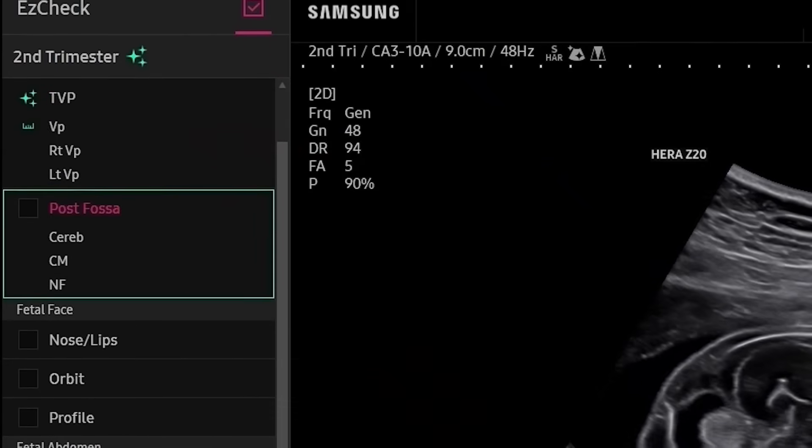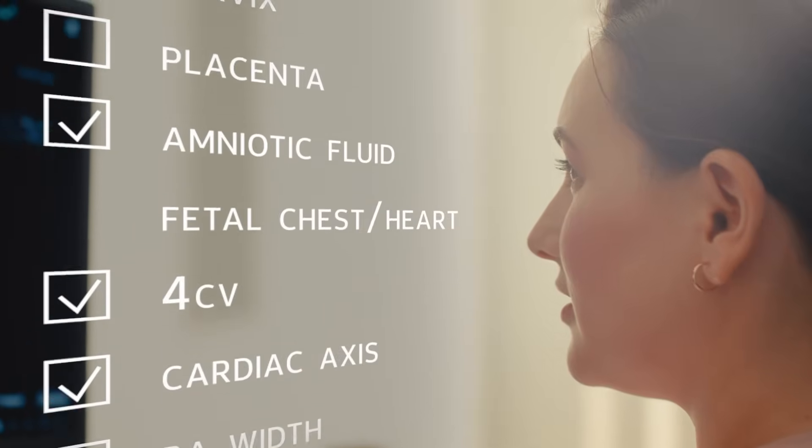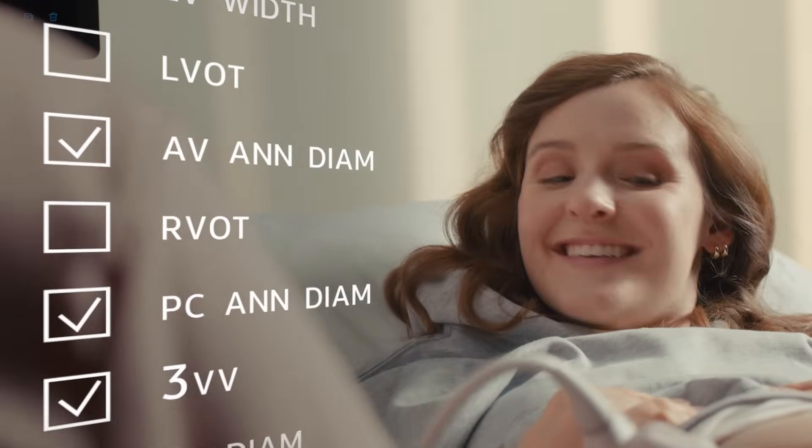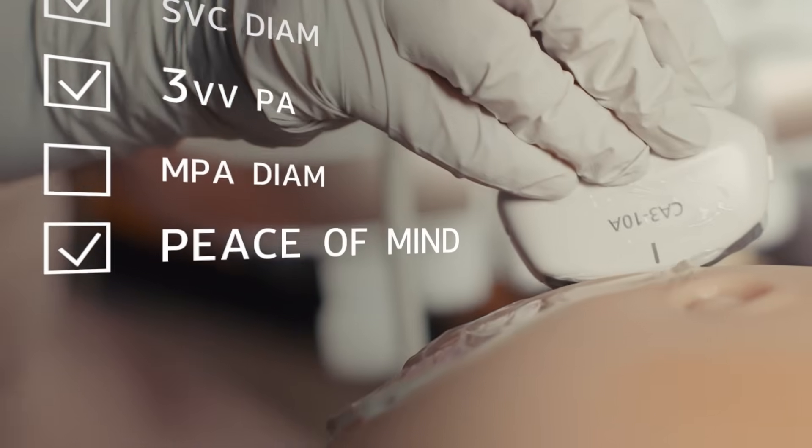Z20's Easy Check feature provides live access with quick reference so users always know the exam status. Live View Assist and Easy Check improve exam efficiency and consistency with users of all skill levels.